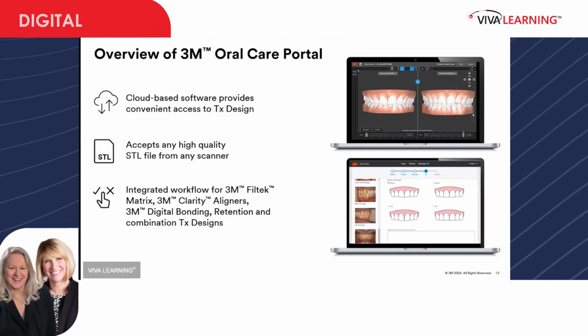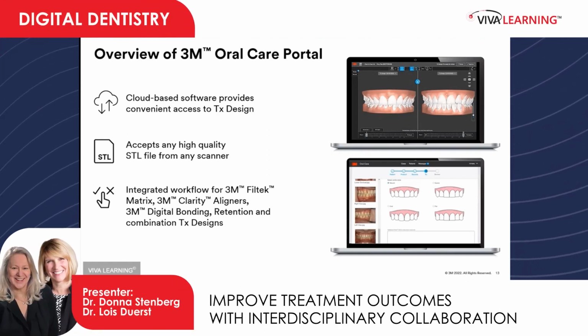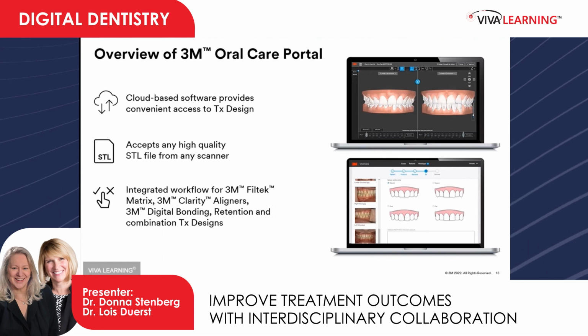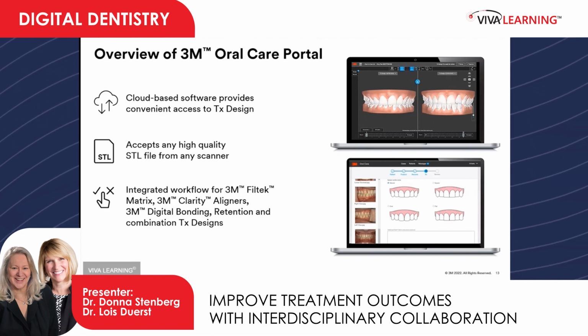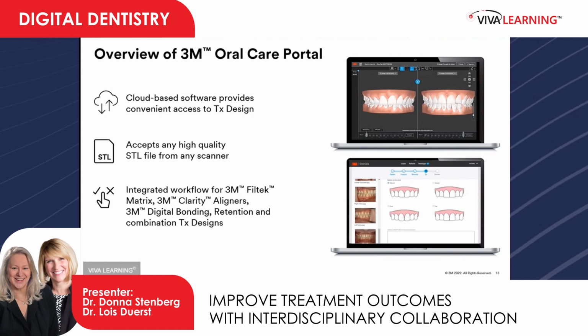The basic forms of communication that we used with the case we are going to present today was a 3M oral care portal. The oral care portal is part of a digital workflow. While many orthodontists are probably familiar with some sort of digital workflow when doing aligner therapy, you general dentists may not have ever utilized a digital workflow.